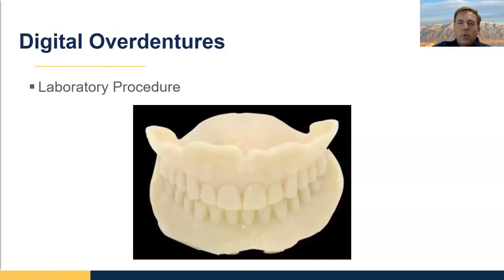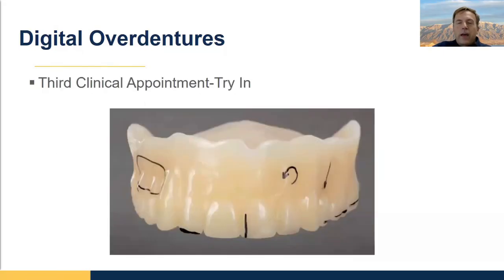And then when you get to this point, you can try it out, try that fine tuning. Because our goal is, hopefully this is perfect and we're just going to flip it to pink and white. But if it's not, our goal is for you not to be doing adjustments with your final restoration. Our goal is get this either perfect or pretty close, make predictable adjustments so that way you're not having to mess with it.